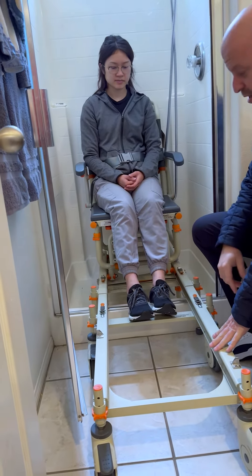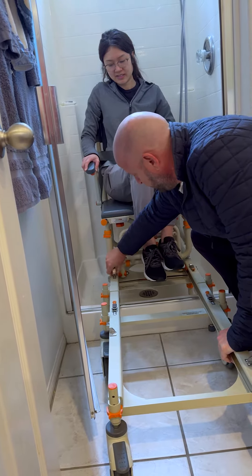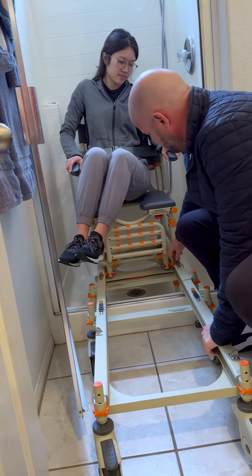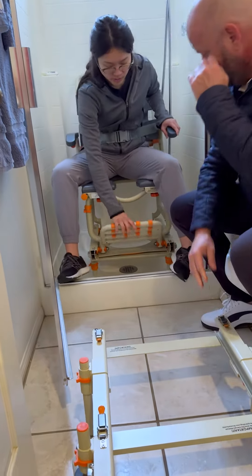Now she's inside. We have a footrest on there which we're not using, but she always pulls her pants up with her. We'll detach the bridge and show the footrest.